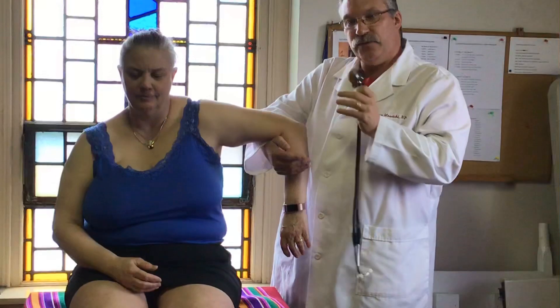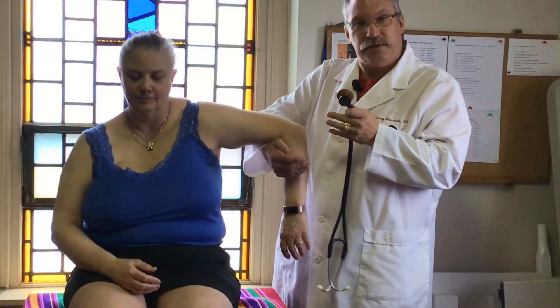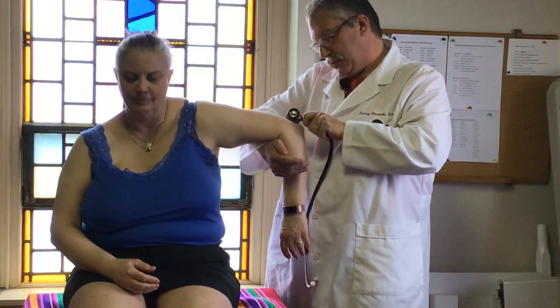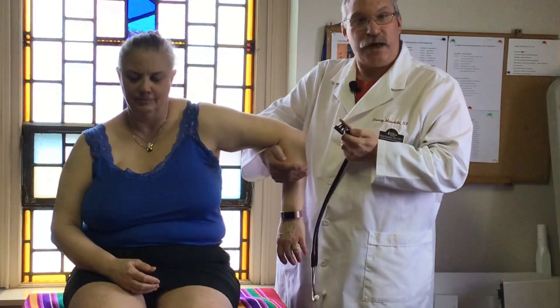The reflex is not going to be abrupt — it's going to be subtle. And that's the tricep.